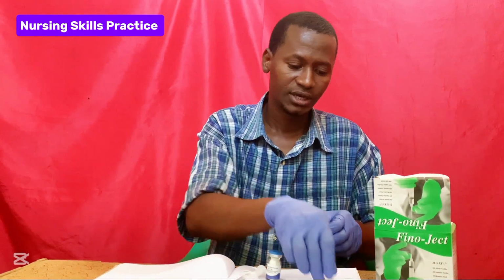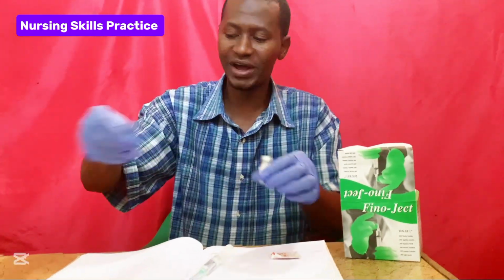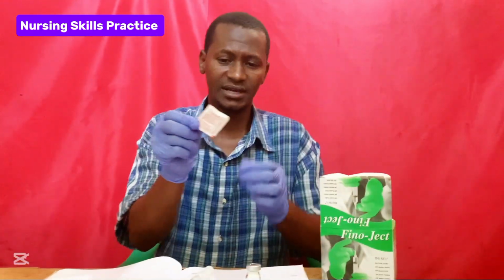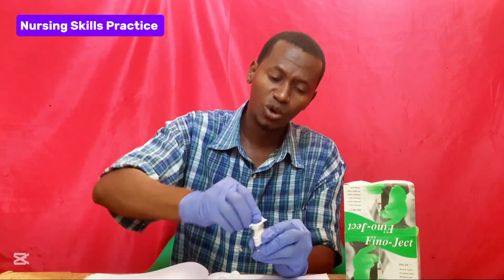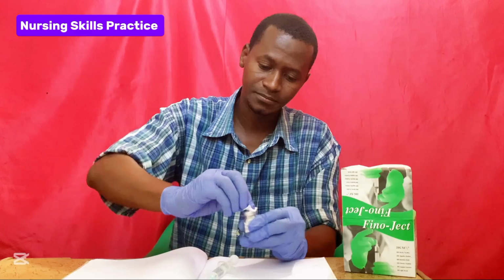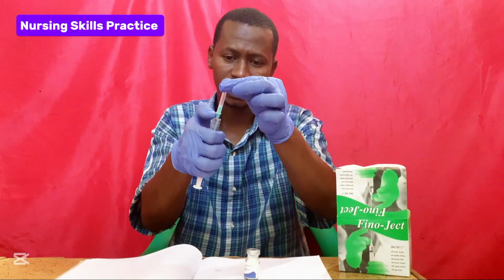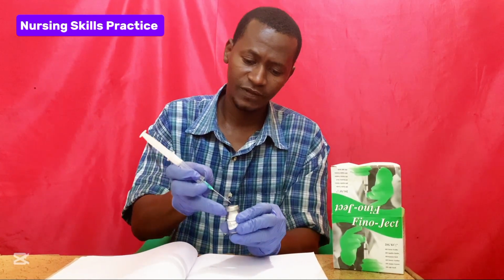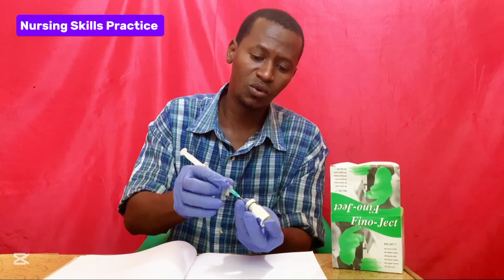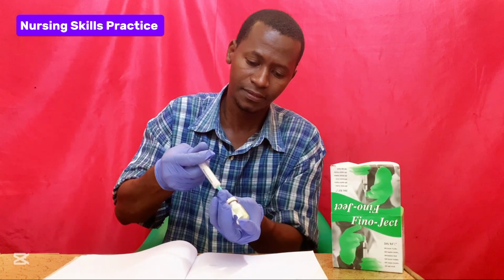Then you flip over the opening of the vial. Then you get an alcohol swab and clean the opening of the vial with the alcohol swab. Then you get the syringe and remove the cap of the needle. Then you inject the sterile water for injection into the vial containing the white powder of ampicillin injection.